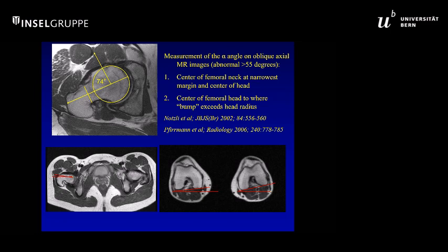In young patients, we always evaluate femoral version as well. You can get a low-resolution image of the distal femora and then provide a measure of femoral anteversion or retroversion on the same imaging test, obviating the need for ionizing radiation from CT.